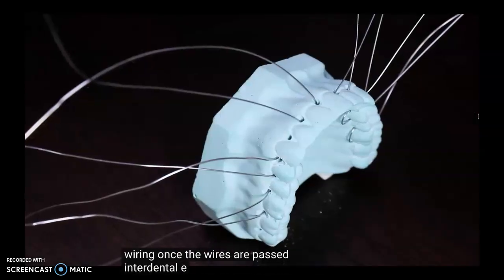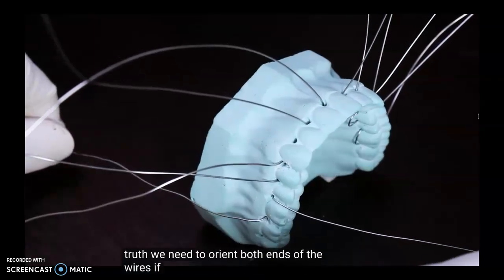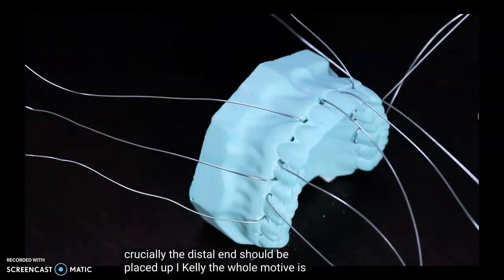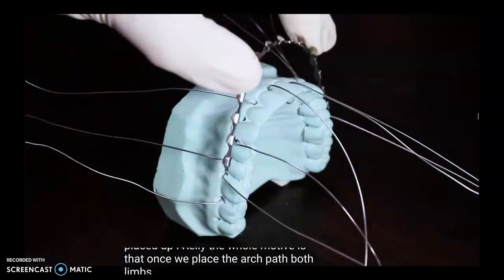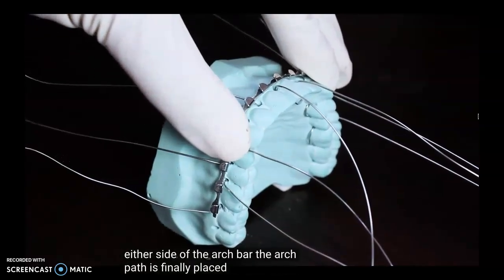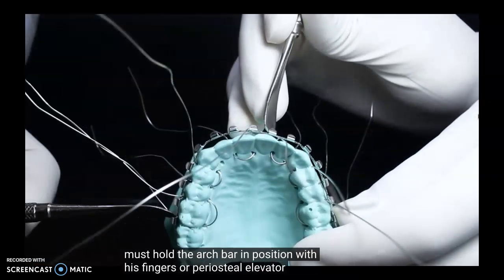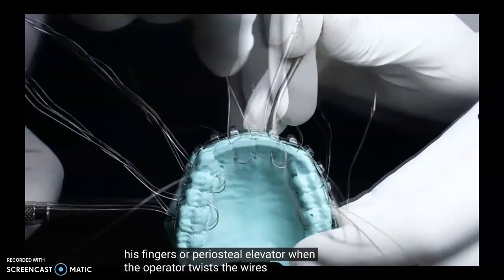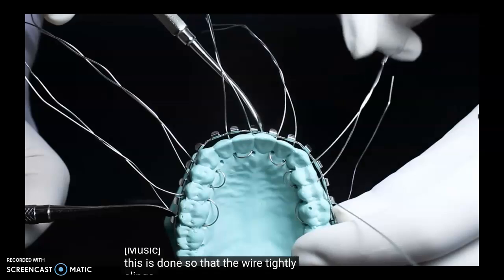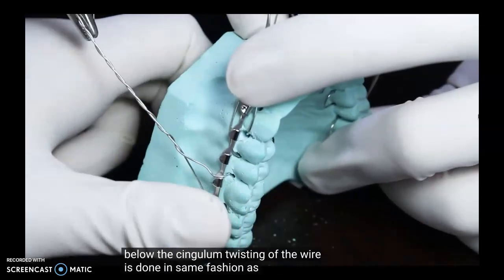Once the wires are passed interdentally around the embrasures of the tooth, we need to orient both ends of the wires. If the mesial end is oriented occlusally, the distal end should be placed apically. The whole motive is that once we place the arch bar, both limbs of the wire should be on either side of the arch bar. The arch bar is finally placed. The assistant must hold the arch bar in position with his fingers or periosteal elevator when the operator twists the wires. This is done so that the wire tightly clings around the neck of the tooth below the cingulum. Twisting of the wire is done in the same fashion as in bridge wiring.